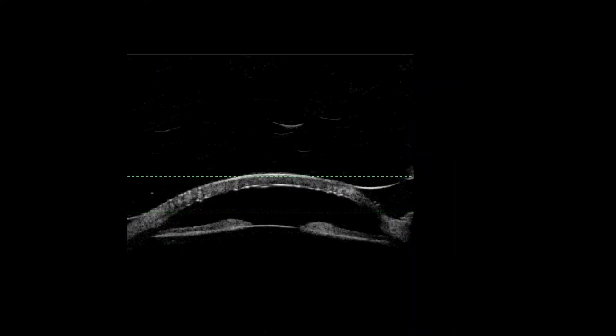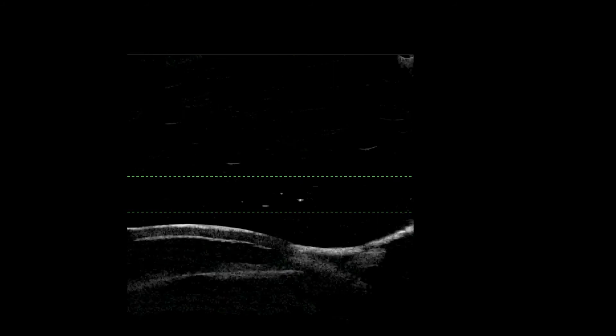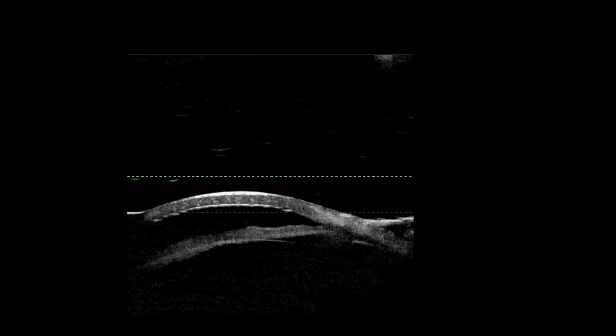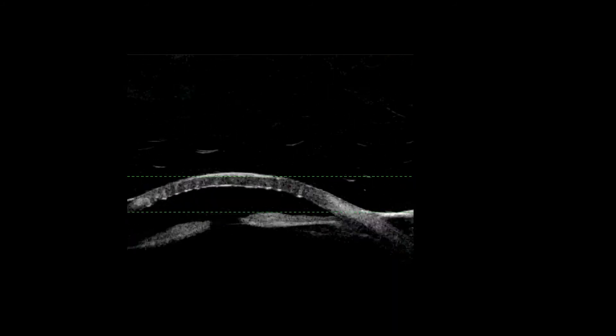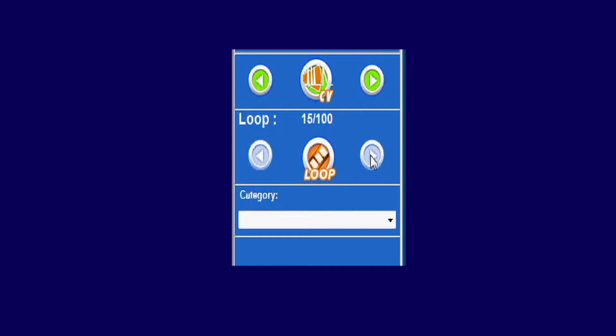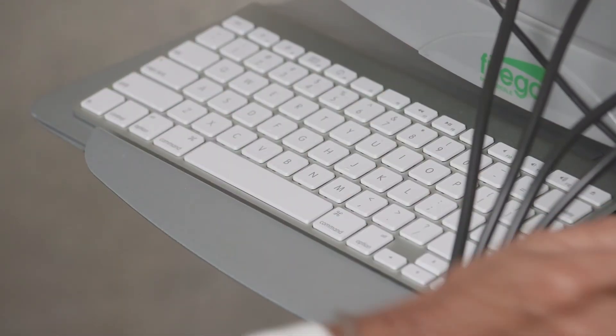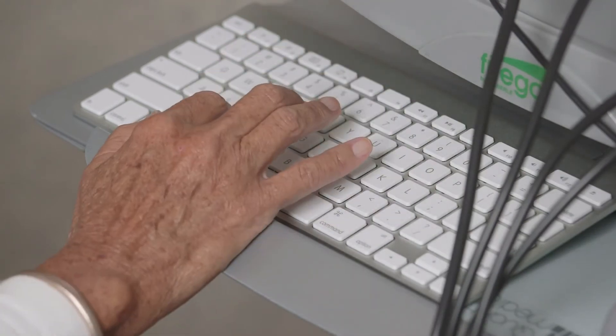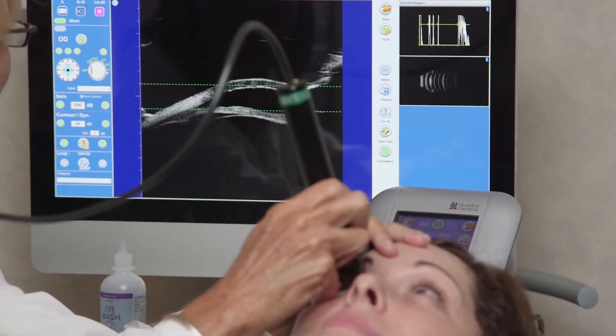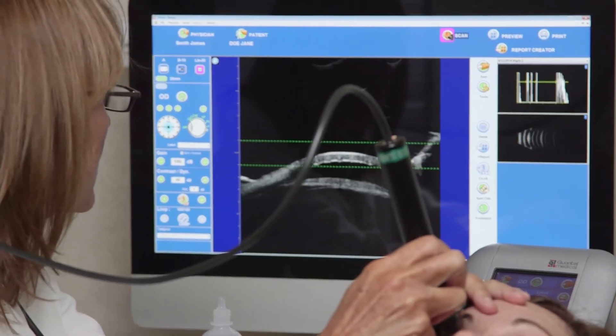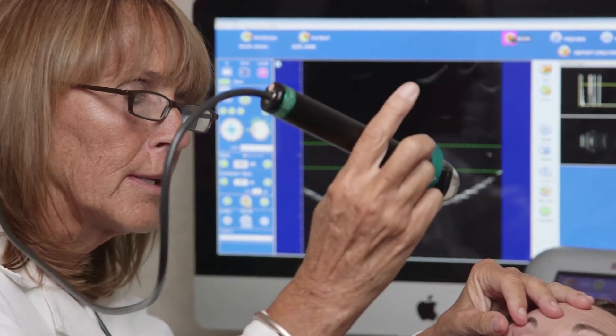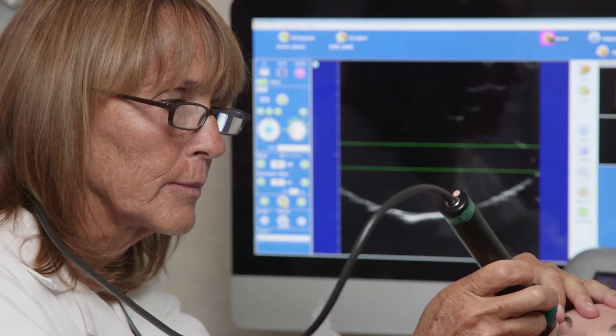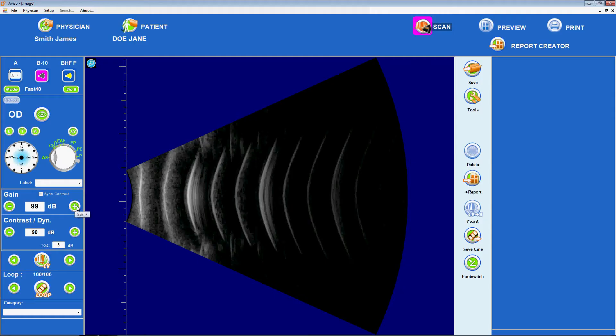The Aviso-S CineLoop tool records a sequence of scan images, up to 100 images, which can be reviewed by the examiner in a continuous loop by pressing the loop icon to start and stop or one by one using the arrow icons surrounding the loop icon. If desired, the keyboard can also control the CineLoop functions. C starts and stops the CineLoop. B selects the previous image in sequence. And N selects the next image in sequence. By default, the CineLoop function is set to capture 100 images.